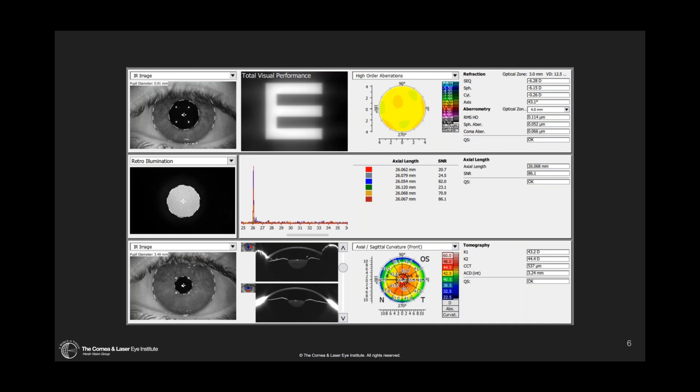This is our setup in our office. You can see our Pentacam Wave AXL on the right. The Wave AXL has three main sensors: optical biometry in addition to Scheimpflug tomography and wavefront aberrometry. When we look at these together, we get a full comprehensive report on an individual's ocular system — mapping the cornea, the vision of the individual, and the length of the eye.